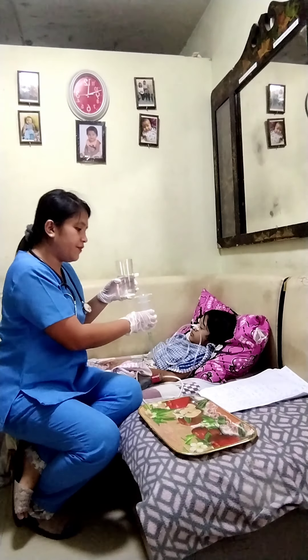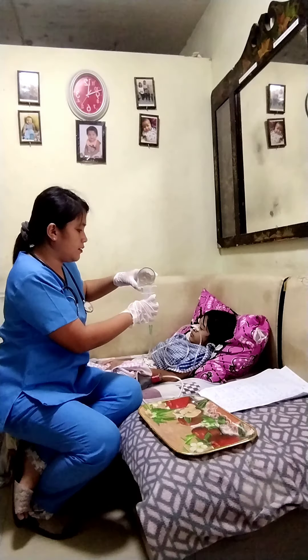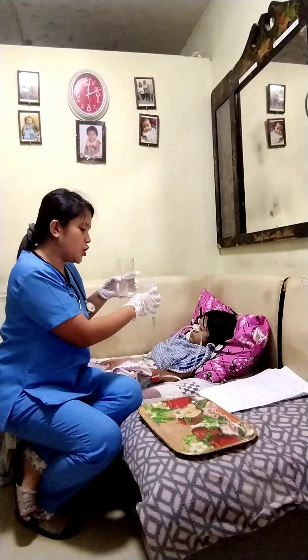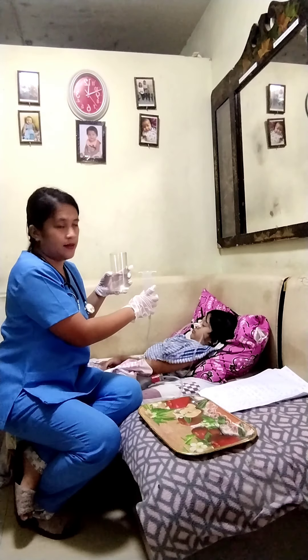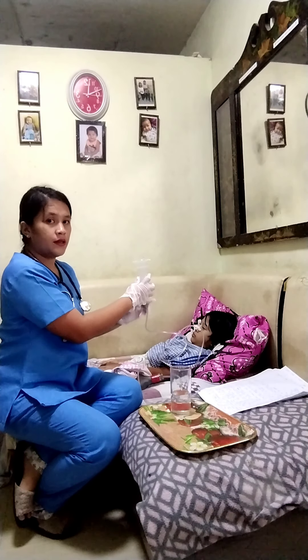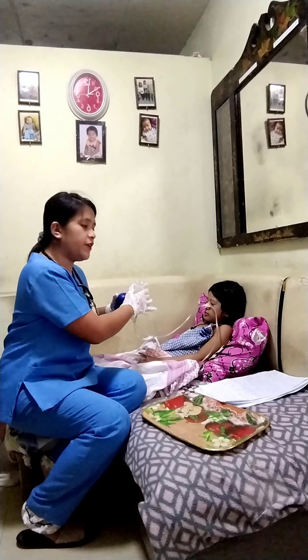Next, we're going to flush the feeding tubing with 30 to 60 ml of water. Cleanse the lumen of the tube. Then we're going to crimp the Asepto Syringe once the water runs through it.